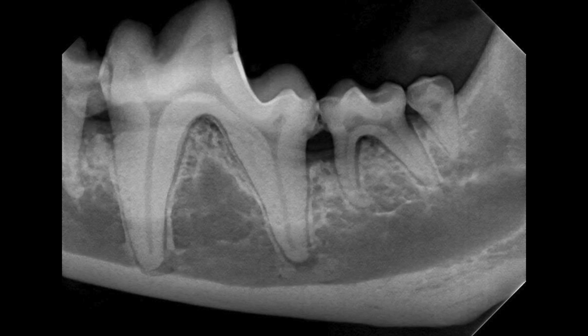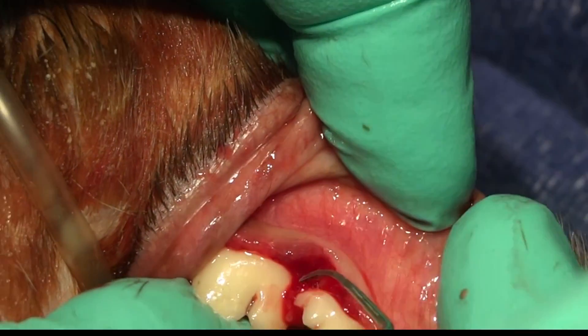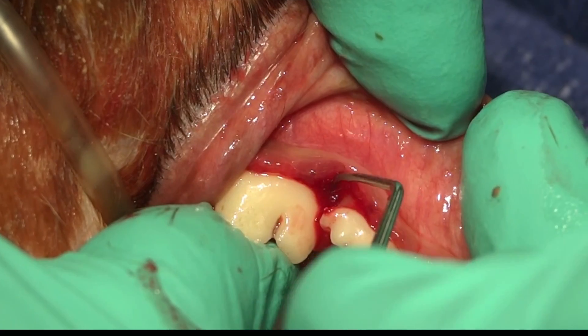You can see here the marginal bone has been lost on both the mesial and distal aspect. These arrows point to the coronal most aspect of one wall. You can see very closely the one wall that's present there.